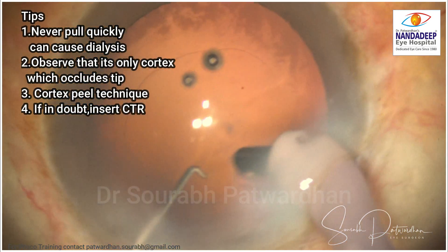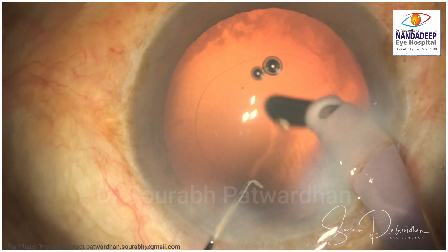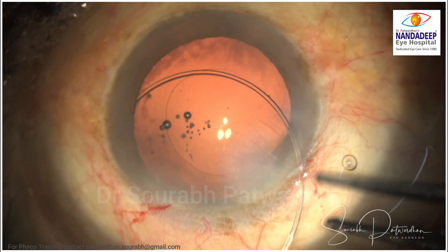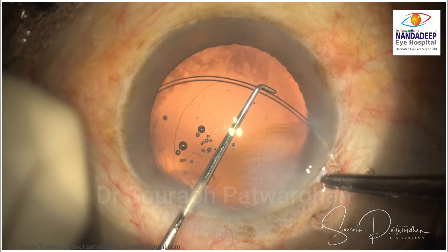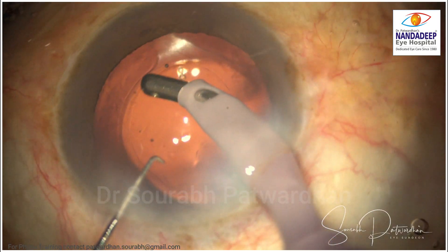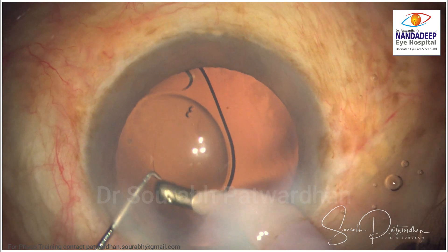This is a very subtle anterior zonular weakness. You can see the fluctuating anterior capsular rim. If you are not careful, if you don't watch these subtle signs and you pull the anterior capsule, it is going to get converted to a frank dialysis. It is best if we could avoid any iatrogenic further damage to the zonules which are already weak. In these cases I always use CTR at the end because we want proper centration of the IOL in the future. After putting the CTR you will find the anterior capsular rim is very stable and stops fluctuating, indicating that the CTR has given good support to the entire bag. We can put a premium IOL and be sure it is going to be centered.